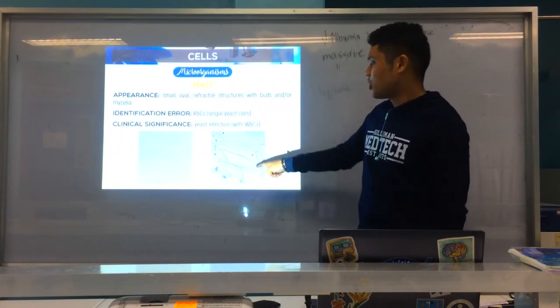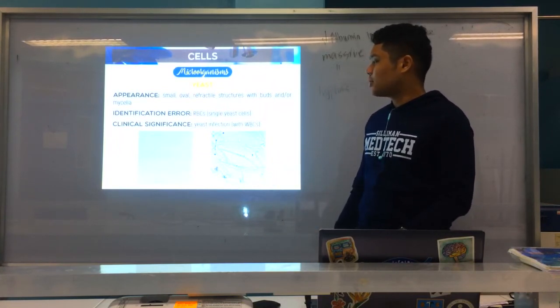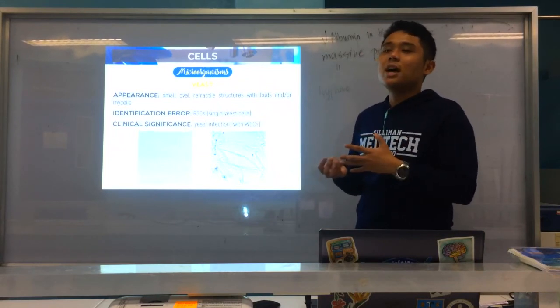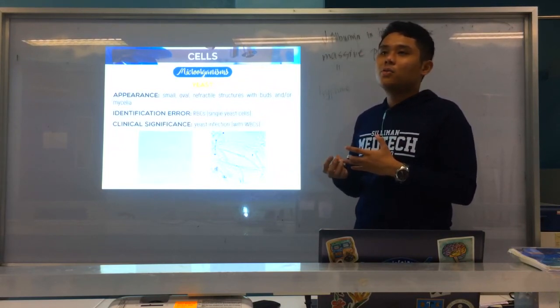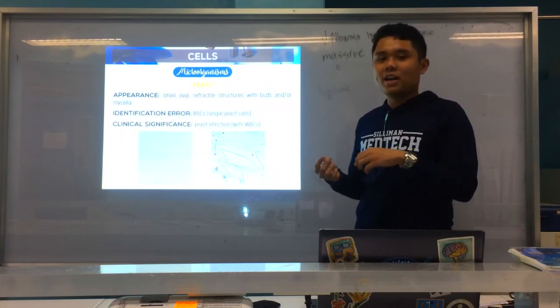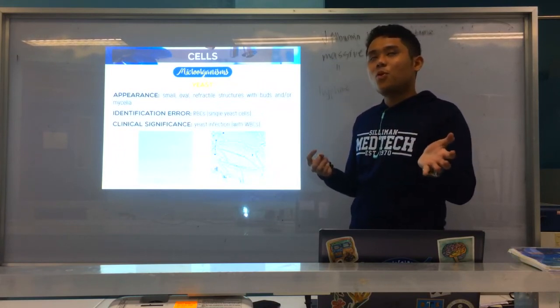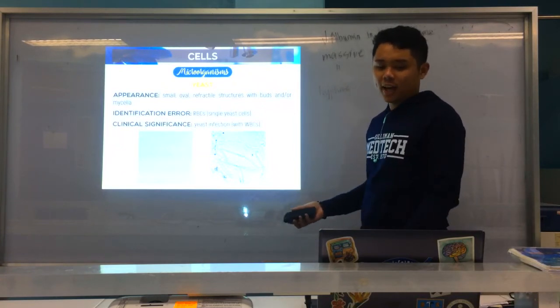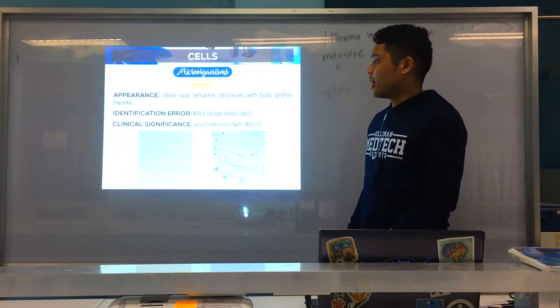Okay? So, basically, your hyphae are just mga structures, additional structures, or your main structures ay mga yeast or sa molds, usually for survival, usually, di ba? Vegetative or aerial. Depende for spore production ba siya or for nutrients, pagkuwag nutrients. Okay? Alright, that's yeasts. Okay, alright.